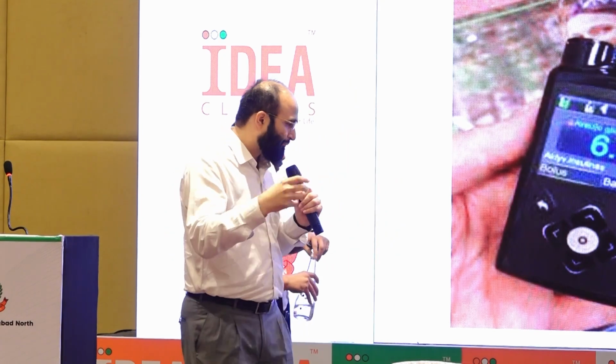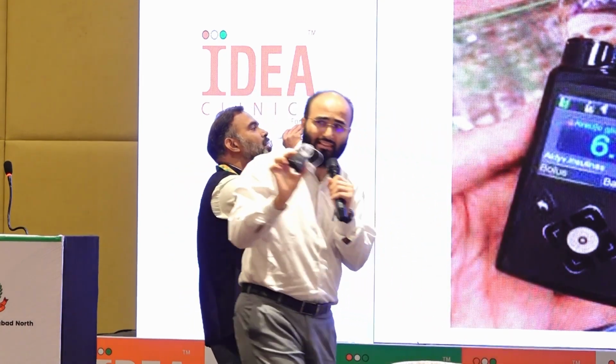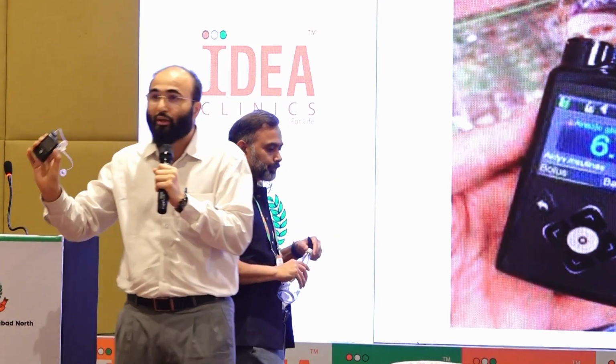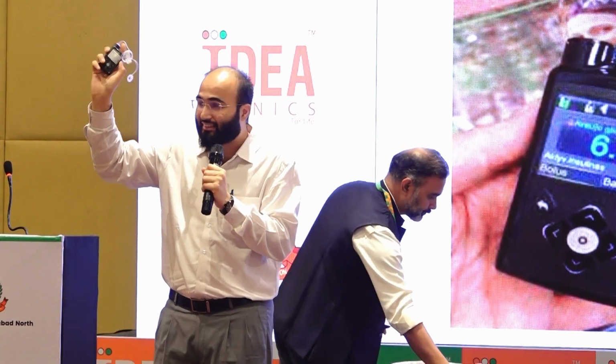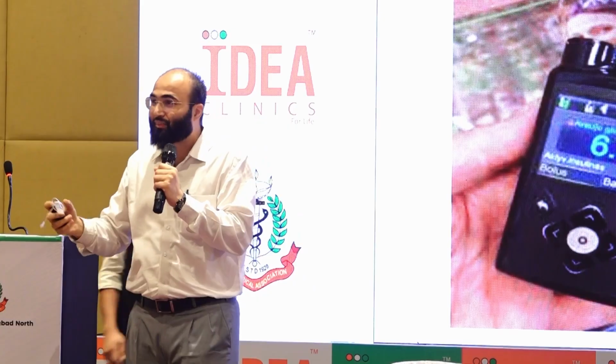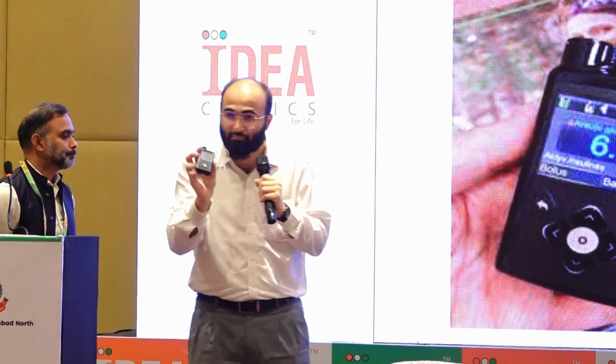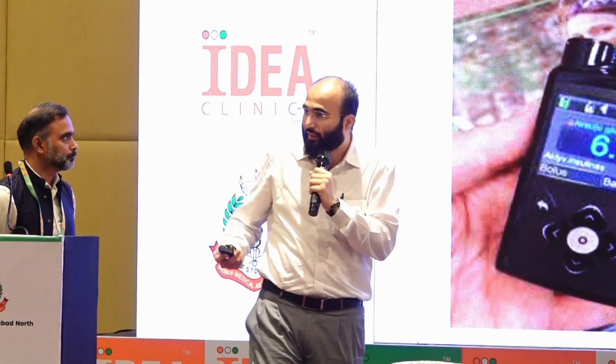And now imagine, this is a pump, a very small device. When it was first invented back decades ago, it was like a backpack. And today you have a pump that can be just in your pocket.